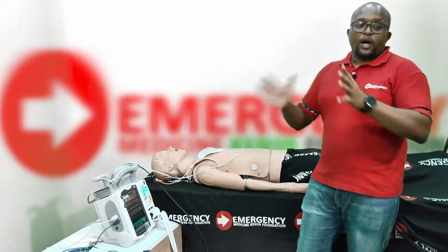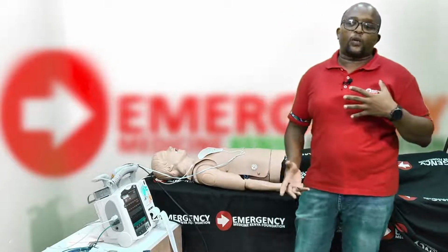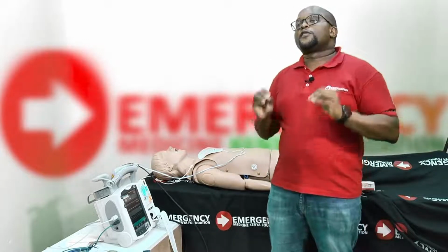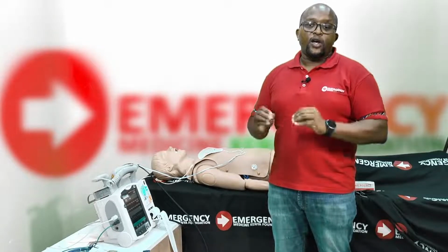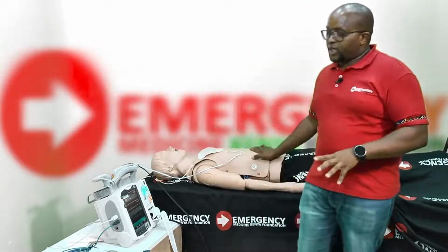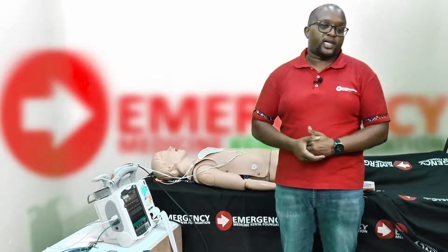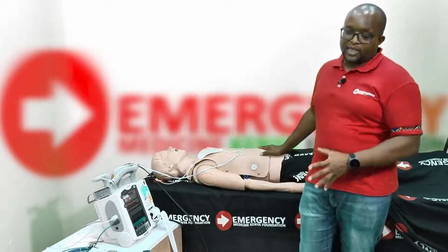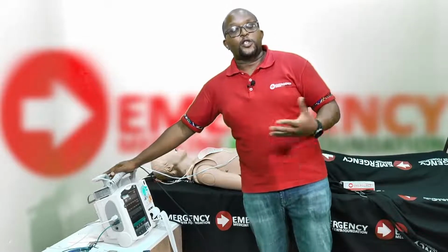All right. Now, maybe one more thing that I can discuss that happens in a situation, especially where EMS are bringing a patient. Remember, I repeat again, if you started pacing, do not stop pacing, okay? Only a cardiologist will stop pacing your patient, because the moment you stop pacing, your patient's vital signs will tank, and that may end up in a cardiac arrest situation. So what do you do when the EMS has brought you a patient, they're pacing, and they want to go away with the equipment?